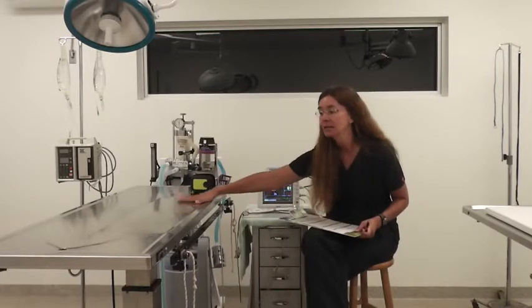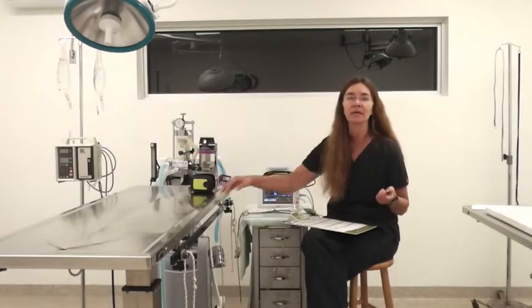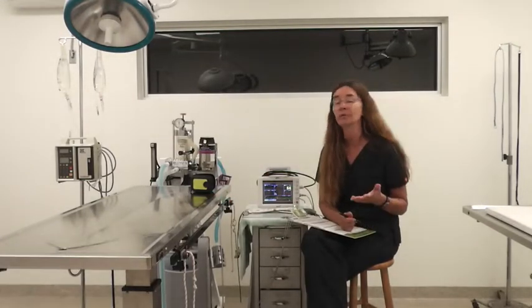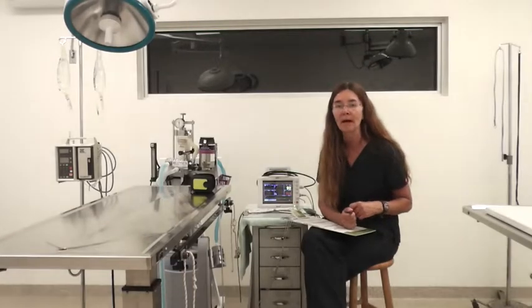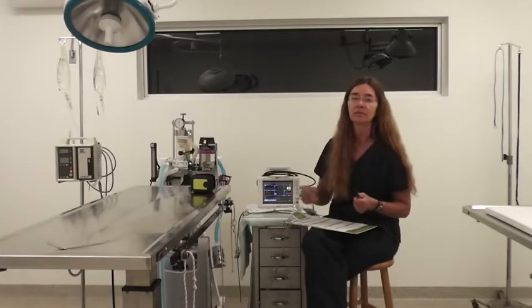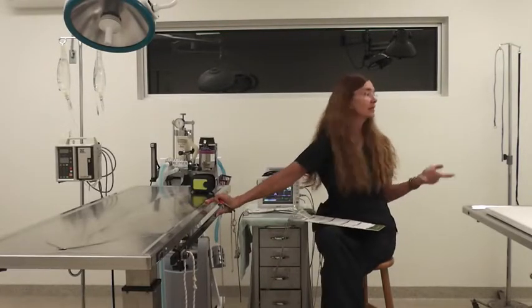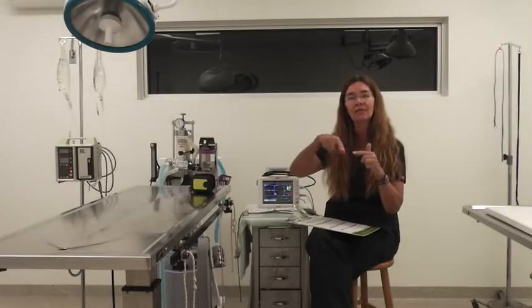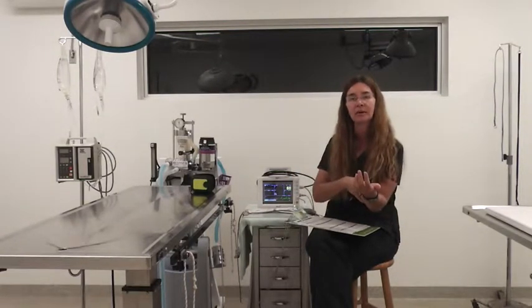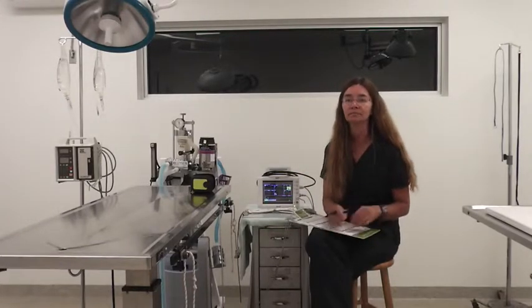Our table is heated, which helps us. You can use Bair Huggers. You can use warm blankets. We also have fluid bags that we put in the microwave to warm up. We have another type of warmer that we use for dentals; once the patient is placed on it, the heat starts, so it keeps them warm. So anything that you can do to keep a patient warm. We also have an egg. I don't know where our egg is, but you hook the IV fluid through it, and when it pumps into the body, it's warming up the IV fluid that's coming from their bag to keep them warm.